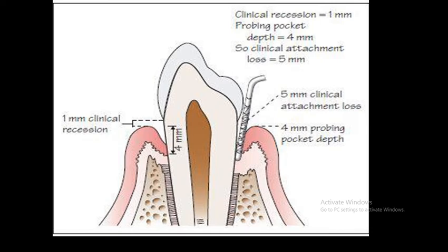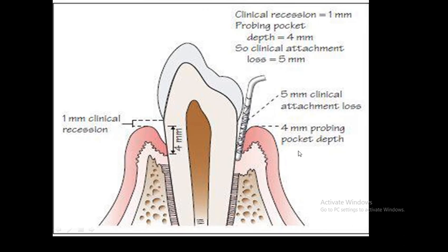The distance from the gingival margin to the base of the pocket is the probing pocket depth. When we place the probe here, it measures four millimeters. So now we have the clinical recession and the probing pocket depth. We add these two together — clinical recession plus probing depth — to give us the total attachment loss, which is five millimeters.